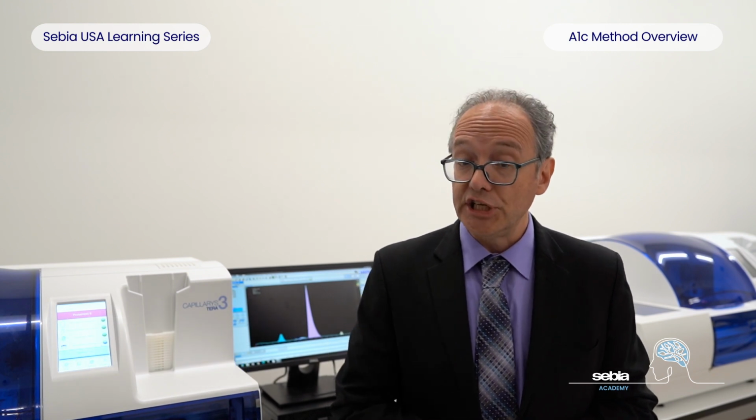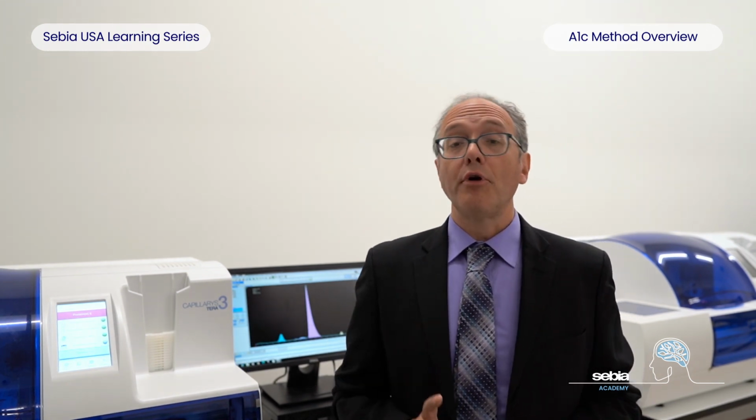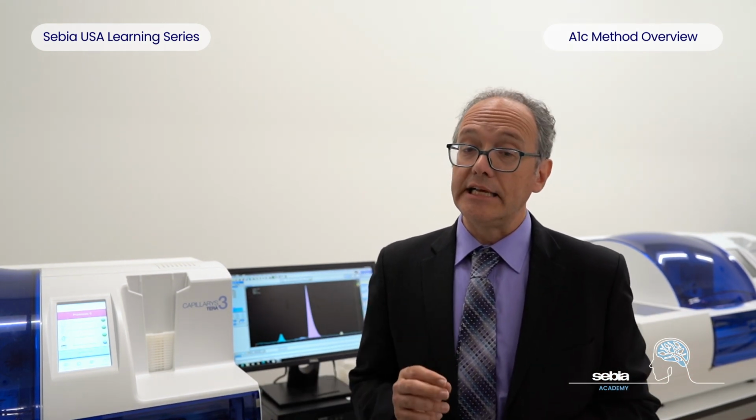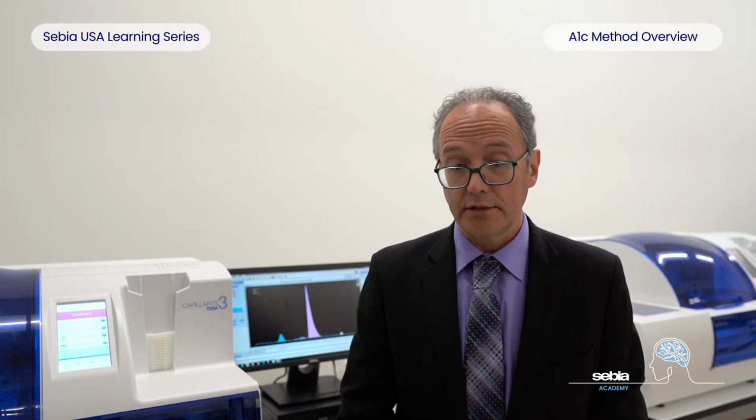Thanks to the establishment in the early 90s of the National Glycohemoglobin Standardization Program, also known as the NGSP, significant progress has been made in standardizing laboratory A1c testing. Today, the hemoglobin A1c test is widely used as a diagnostic and monitoring tool for diabetes, and standardization has helped to ensure consistent and reliable results. This has been an important step in improving the care of people with diabetes.